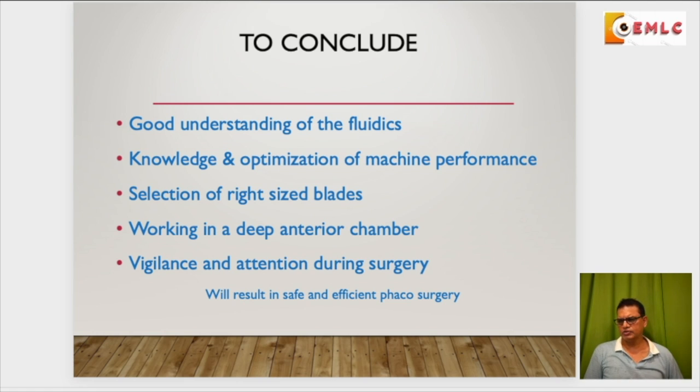What I have not discussed in this is the power modulations, the power that we should use during phaco, which I think once you start doing the phaco, you should be able to understand and modulate according to your own surgical technique. Thank you very much.